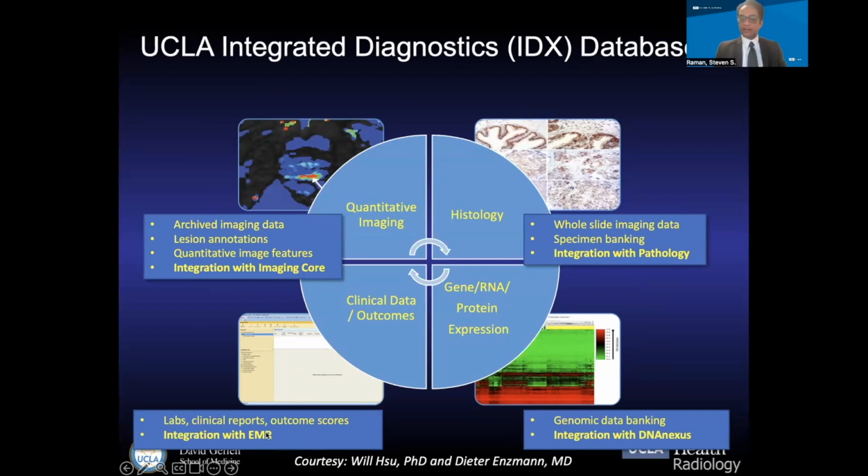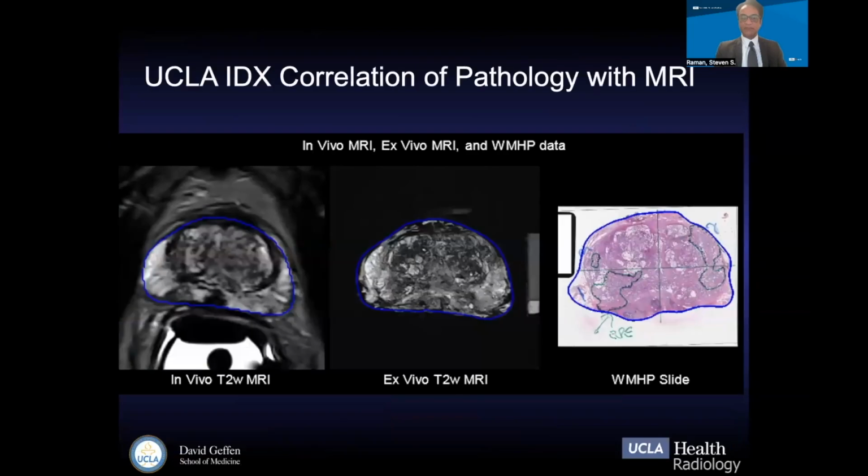And this really enables us to do artificial intelligence and informatics and other disciplines in this very curated data set. So, for example, we can take a T2-weighted image, it's preoperative, show a lesion here, image that radical prostatectomy specimen in ex vivo MR fashion, show that same lesion here, and show that MR visualized lesions on whole mount histopathology, precisely cut with a 3D printed mold, are much more biologically aggressive than invisible lesions that we didn't see on the MR.